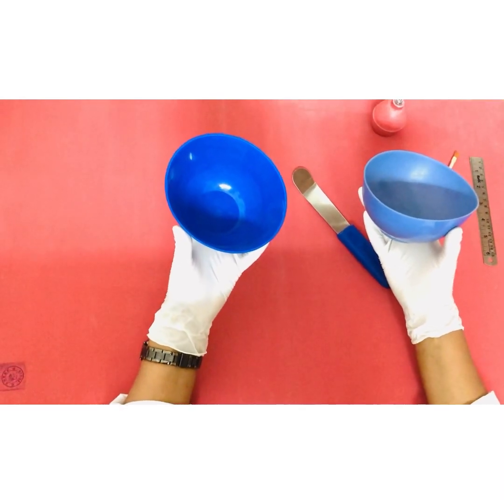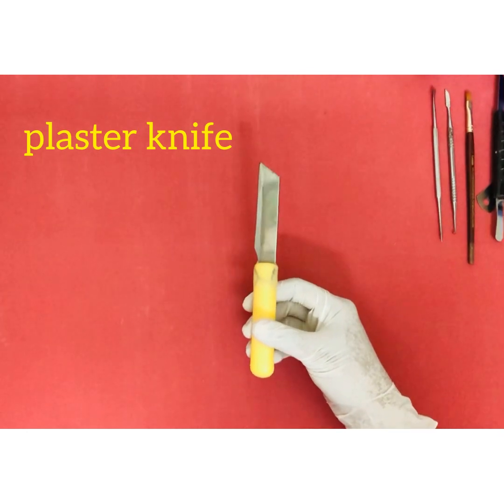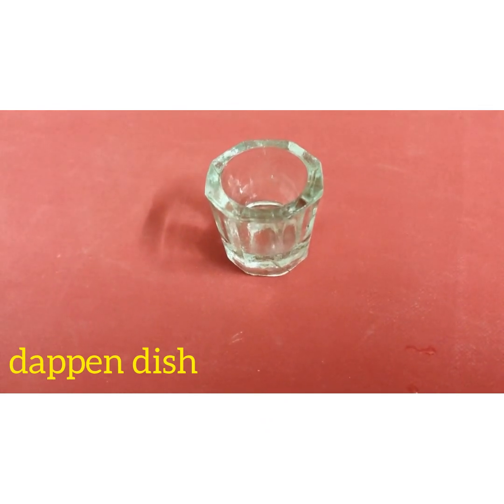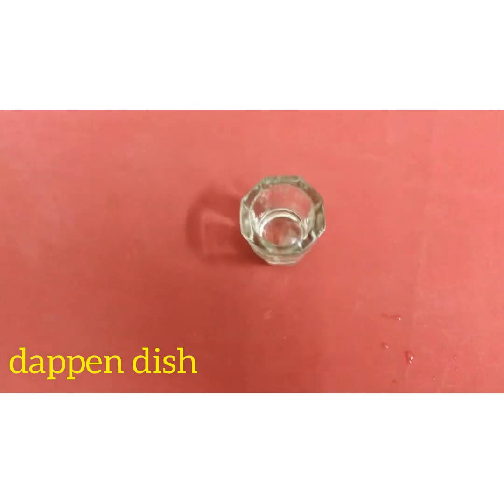Especially the setting time of alginate. A plaster knife is used for cutting and shaping gypsum products before their final set. This is a dappin dish, used for dispensing very small amounts of material, for example self-cure acrylic resin, or to carry separating medium.